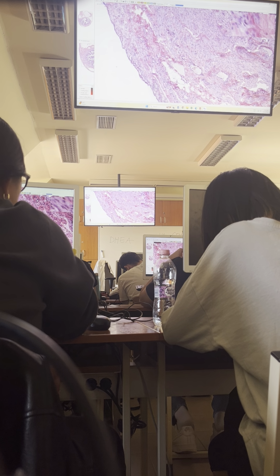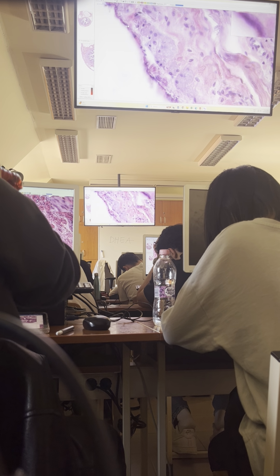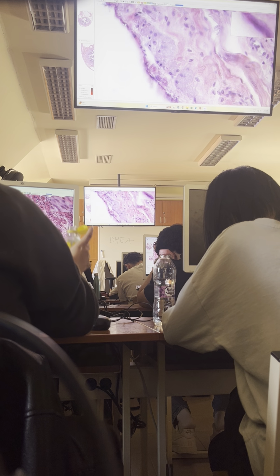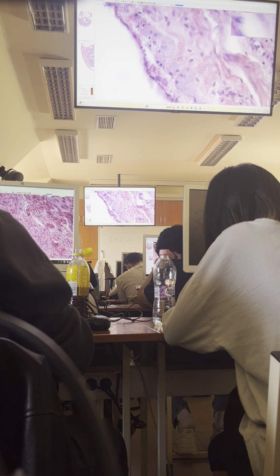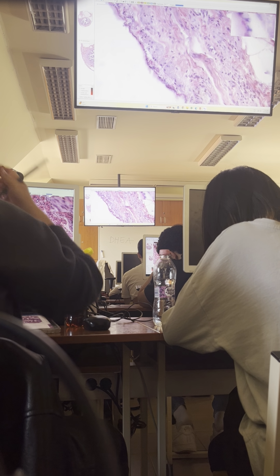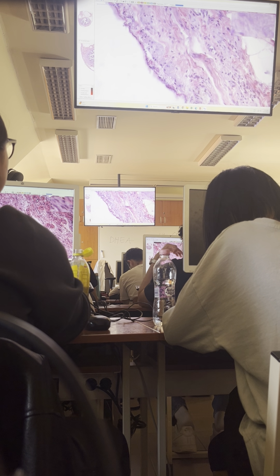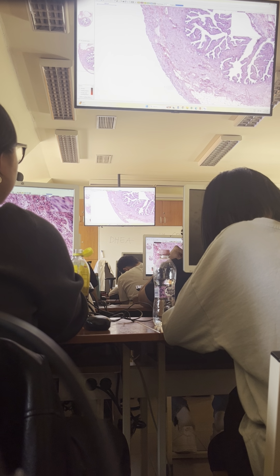And the outermost tissue layer is subserosa and serosa. You can see some mesothelial cells here at the periphery. So this simple squamous epithelium is the serosa layer, and next to it there is some loose connective tissue, which is the subserosa. These are the layers.